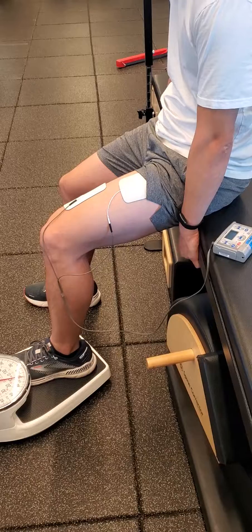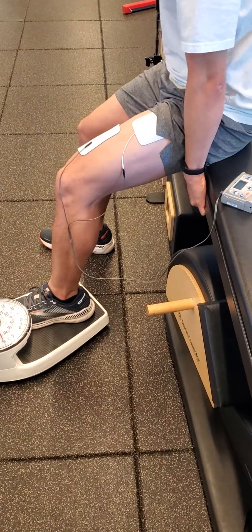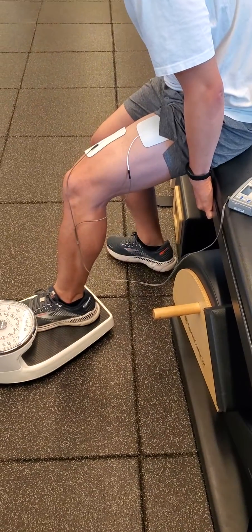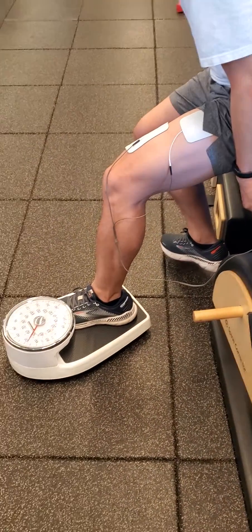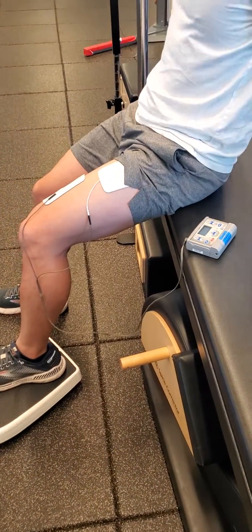I think it snapped. And go — one more rep. Keep going, keep driving. Trying to stand up — yep, there it is, great. Keep it up, keep going. Feel the stim, and then done.